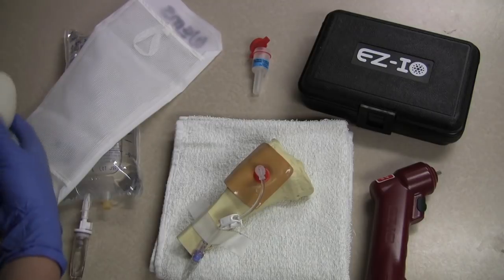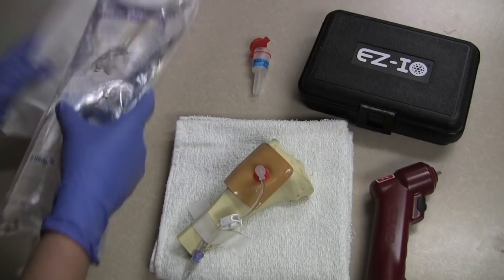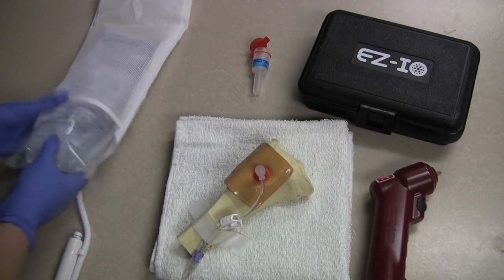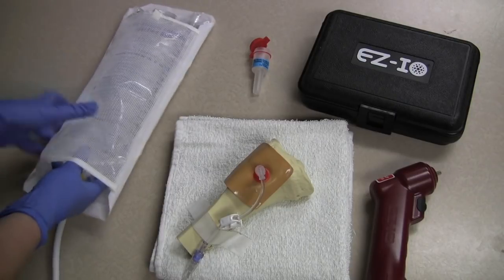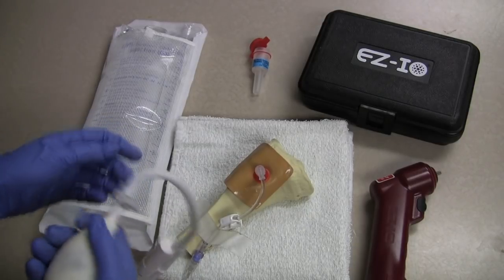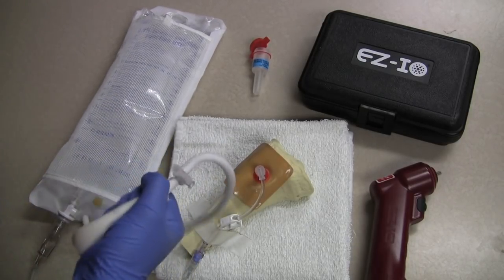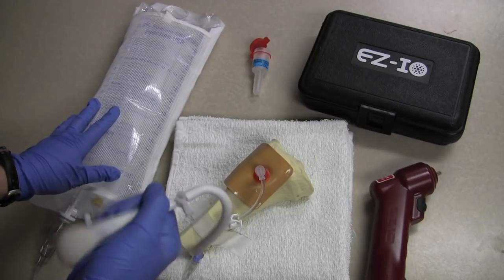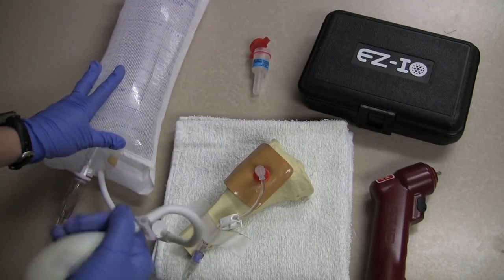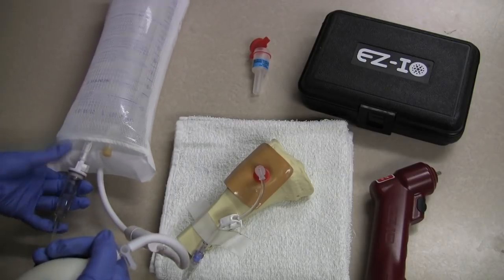This is a pressure bag — it comes with a bulb so that you can blow it up with air. It works just like a blood pressure cuff, and in fact you can use a blood pressure cuff if you don't have a pressure bag. The purpose of using this is because in an IO situation, fluids are not just going to flow through the tubing — you have to put some pressure on them. You know you have the right pressure on the bag when your drips are flowing at the appropriate rate.